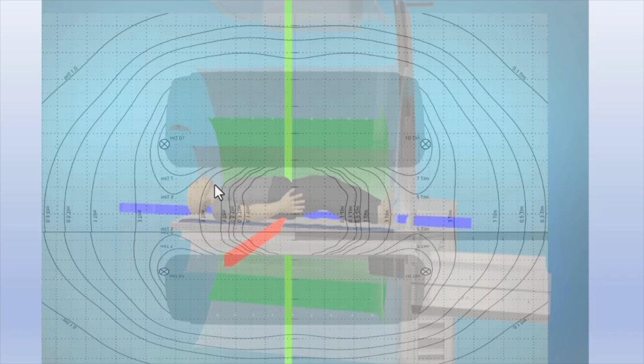And so if I had an implant, and I looked at it and it says don't go anything above 700 Gauss per centimeter, and I look and there's 10 Tesla per meter, I'm like, well, man, that's way higher. So this is the area that you would need to avoid. You'll see anywhere here there's 10 Tesla per meter. Here is 7 Tesla per meter. So if I had an implant that had only been tested or was only safe or conditional to 7 Tesla per meter, then you have to really avoid this area, anything in this area in space.